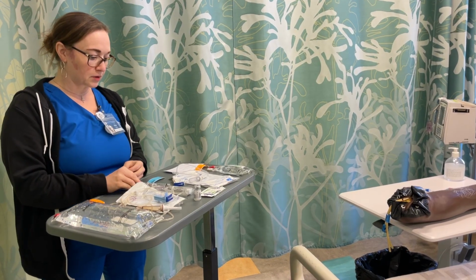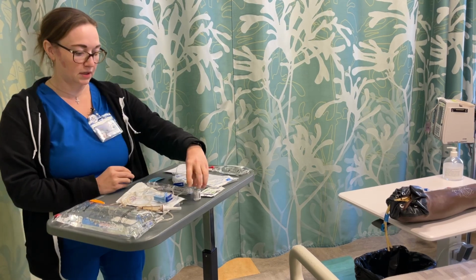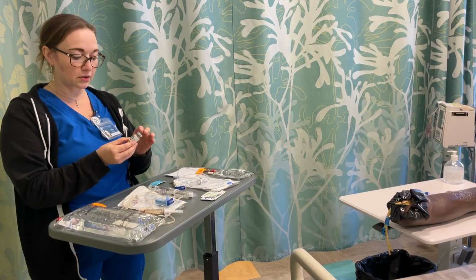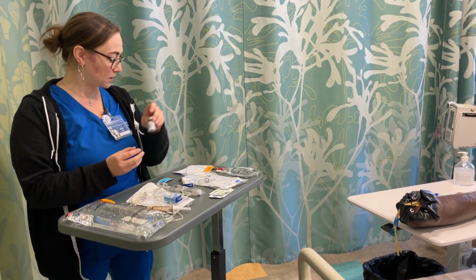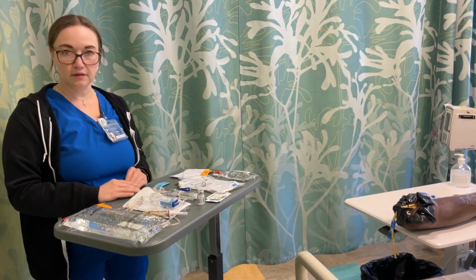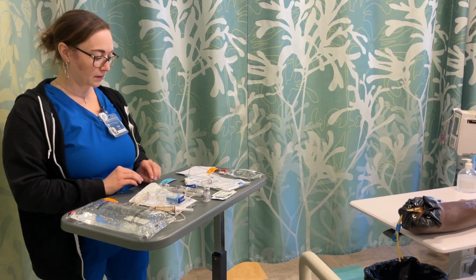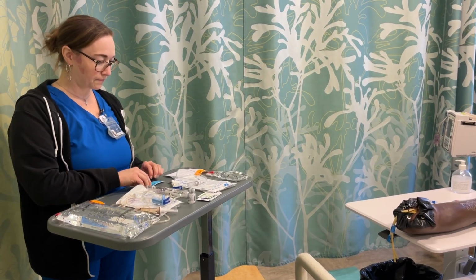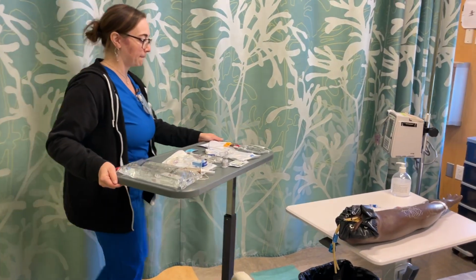So I'm going to be giving her an IV push as well, and that's Ondansetron, and it came in at 2 milligrams per milliliter, and it's for 4 milligrams per 2 milliliters. And that's going to be given to her as well, so she doesn't have any nausea. Okay, and so now I'll go into the patient's room.